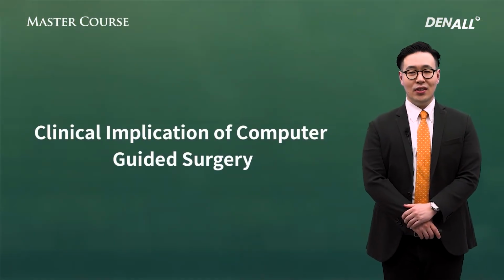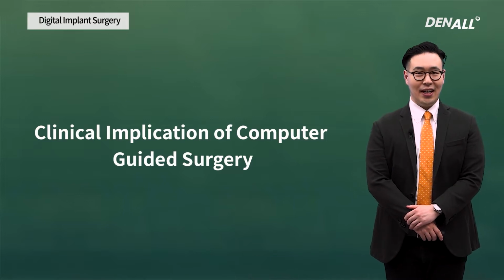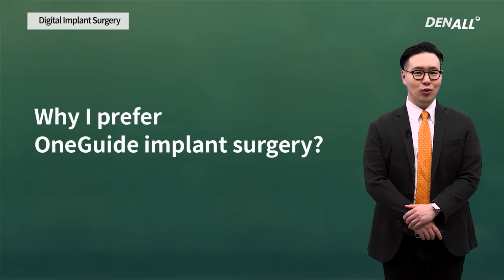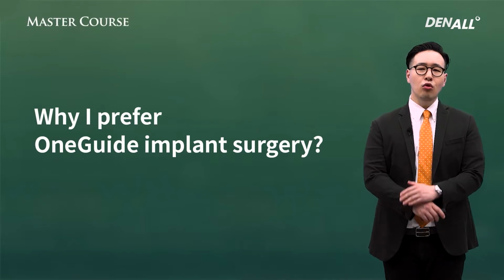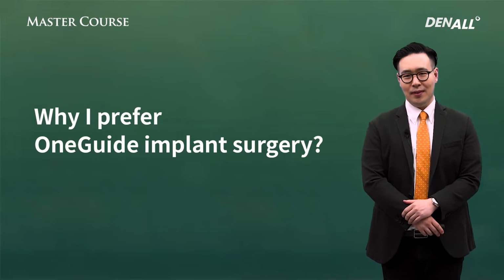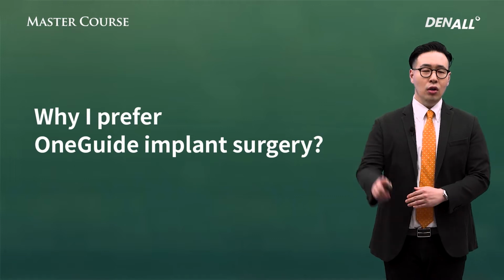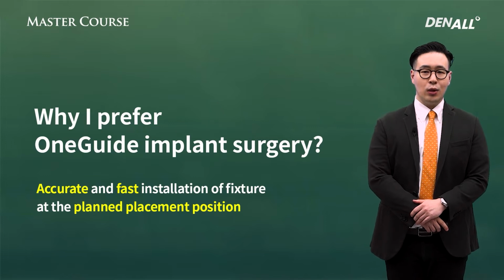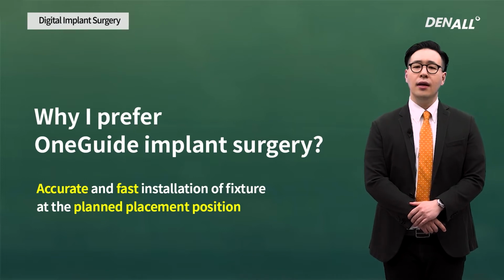Digital surgery using a guide template, is it really helpful clinically? Can we really trust it? I really believe so. Down the road, except for very few cases, the guided template will be more and more widely used. Then, why would I like guided template surgery? Because if the data is merged properly, implants can be placed at the ideal positions faster and more accurately.